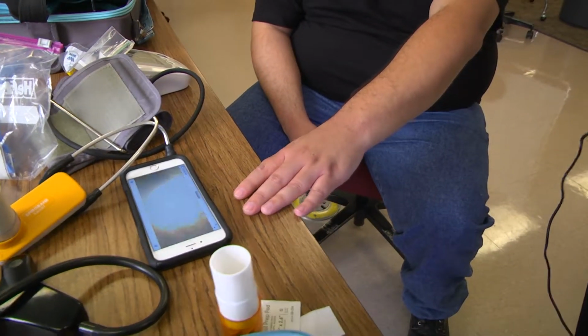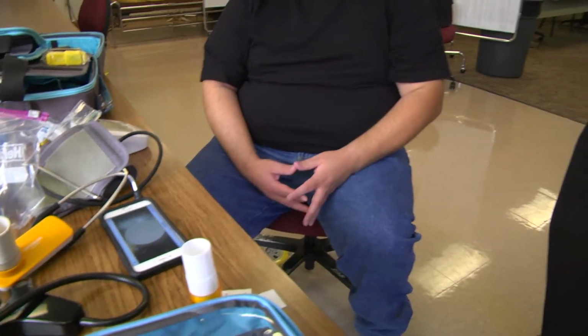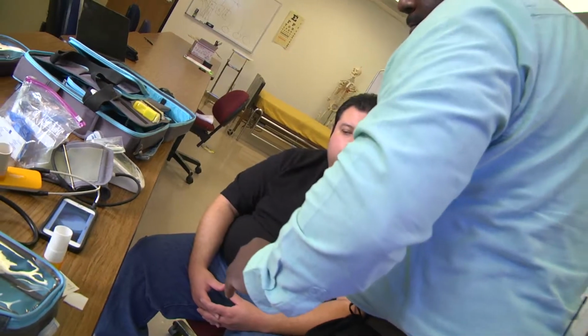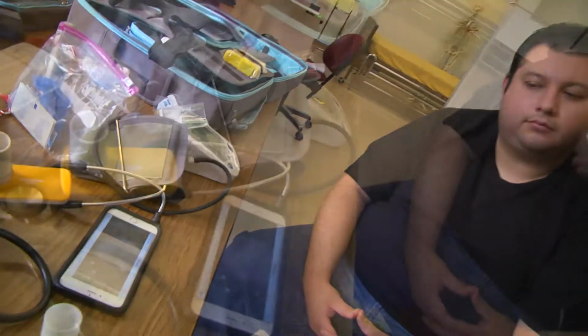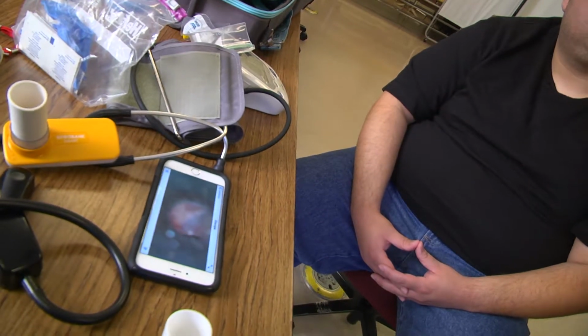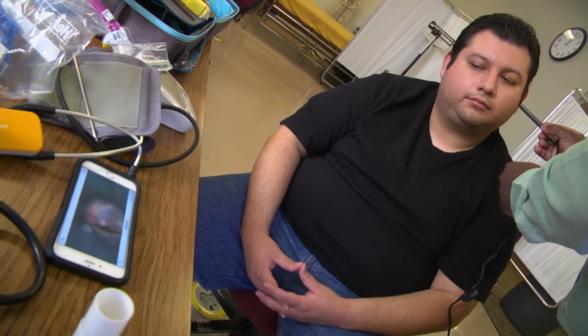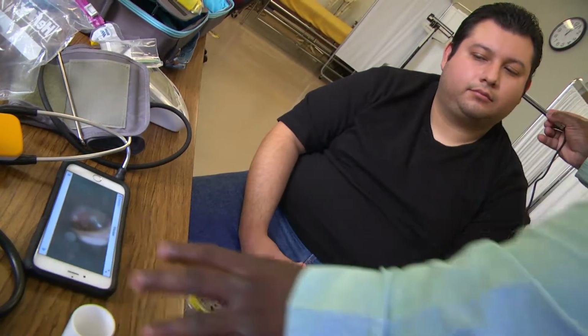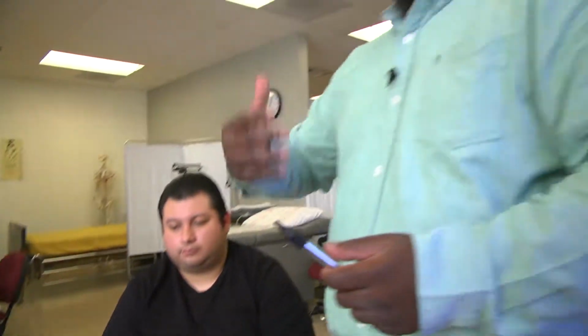Or then I can go and check, say, there might be an indication of infection in the ear, right? So I could go to the ear. Now I'm looking at the ear canal. I'm going to take a picture of that. And I can do the same thing for the nose, and for the mouth.